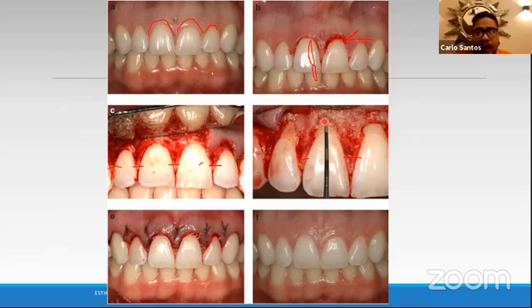So that's very important. And I assure you, in doing this, it won't grow back, right? Like what we have done in the past, using the blade or the cautery, we just cauterize away, and then after 2, 3, 4 months, the patient comes back, and the gingiva returns to how it was before you did the procedure.